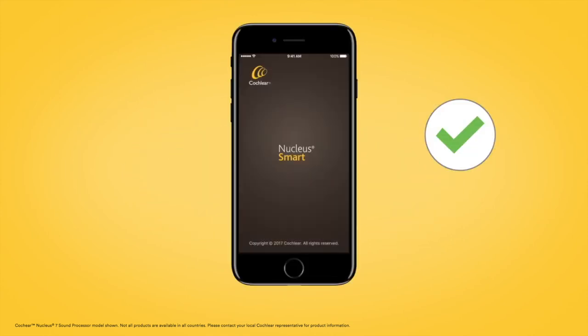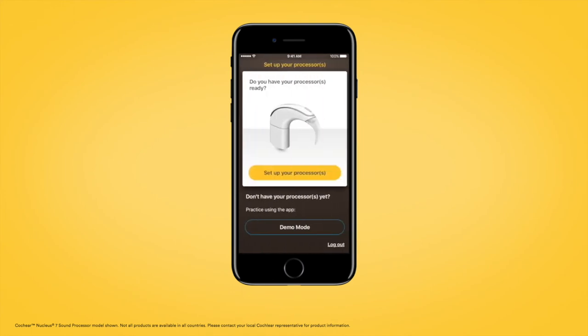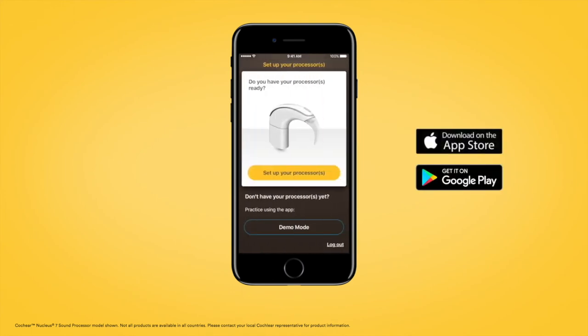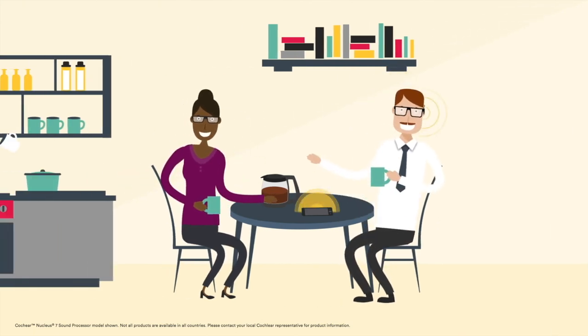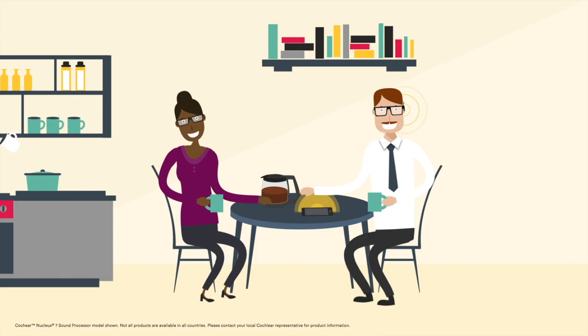Once you have paired your Nucleus 7 sound processor with your compatible Apple or Android device, follow the instructions within the Nucleus Smart App to set up your processor. When setup is complete, you will be ready to use the Nucleus Smart App with your Nucleus 7 sound processor.